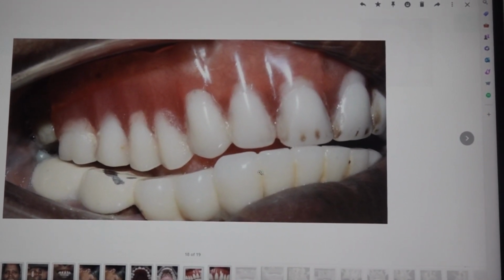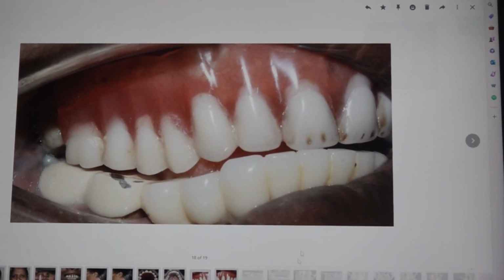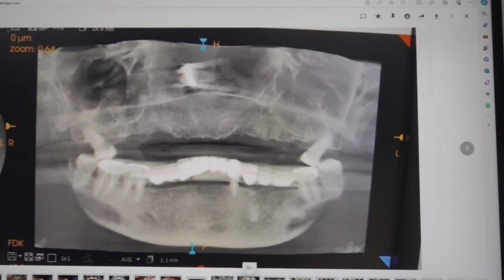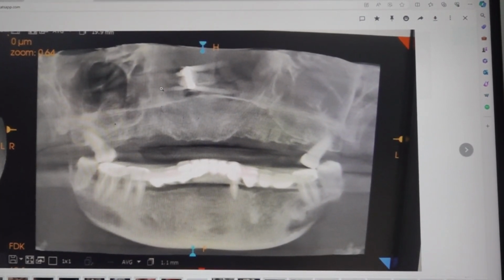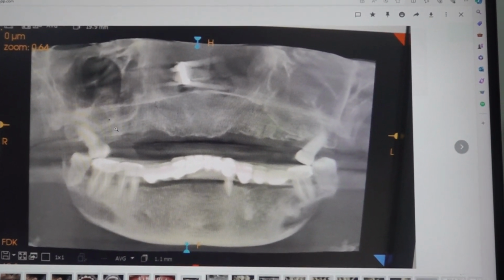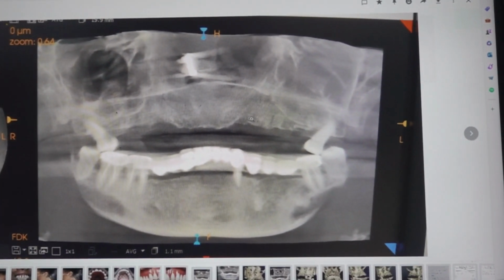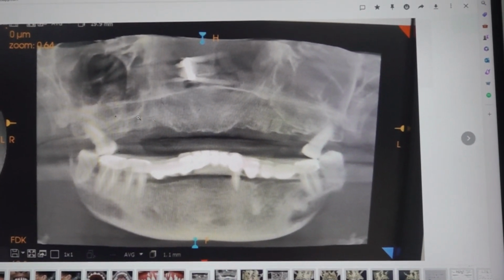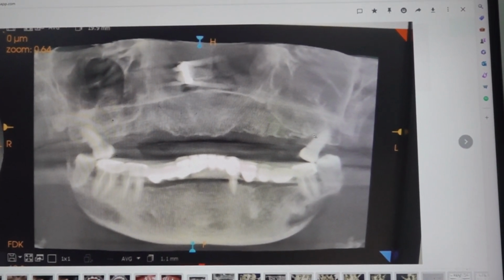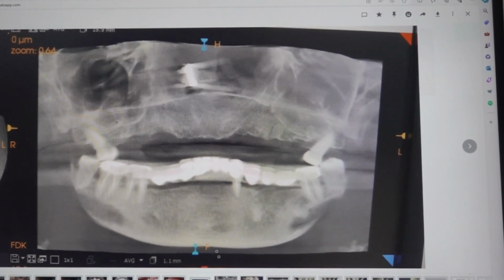A denture with lower anterior ceramic teeth is a recipe for severe bone loss in the upper anterior area. But if you see the panoramic view, there is good height, right? But we don't know about the buccolingual thickness. Of course, we have to do a lot of alveoloplasty, right? The left side sinus is much worse than the right side, right? We will see this.